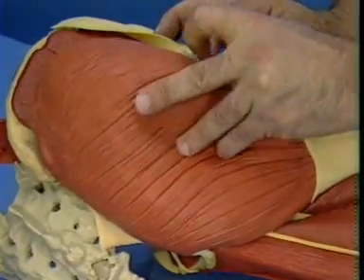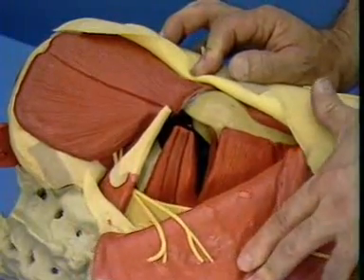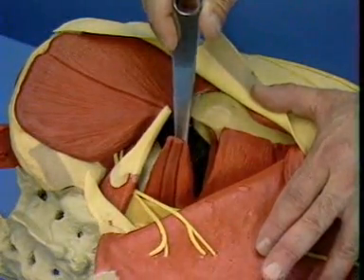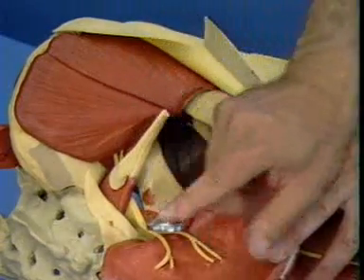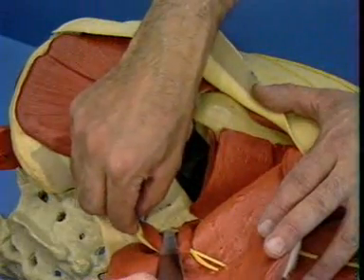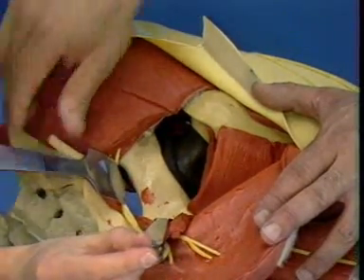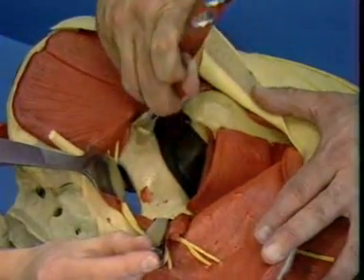The gluteus maximus muscle is reflected posteriorly. A Hohmann retractor is placed into the lesser sciatic notch, retracting the obturator internus muscle and the sciatic nerve posteriorly. The sciatic nerve must be palpated to make sure that the tension is not too great. A second retractor can be placed into the greater sciatic notch, retracting the piriformis muscle.